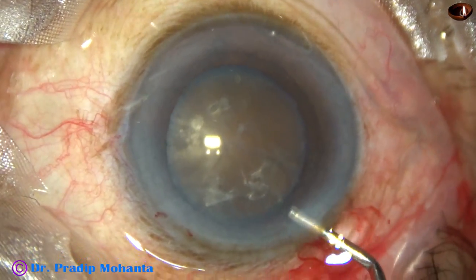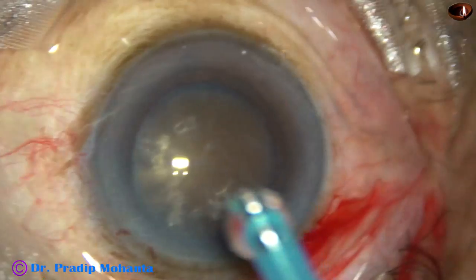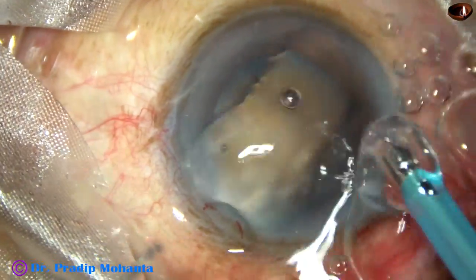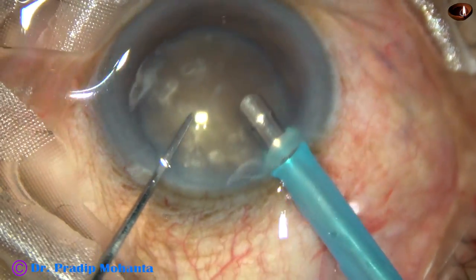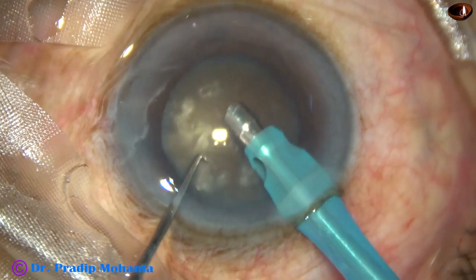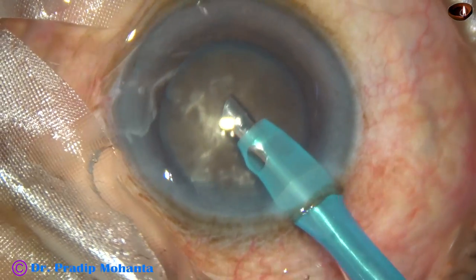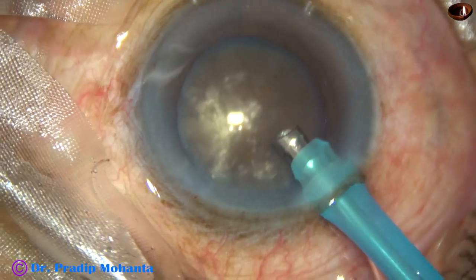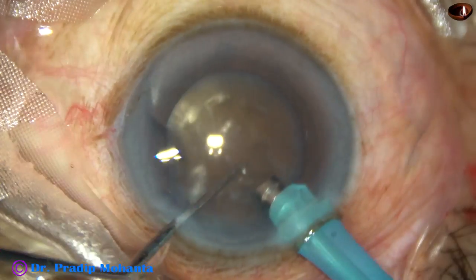Some more viscoelastic is added. And now the tip of the phaco handpiece — the tip of the phaco needle — is being introduced. Look at the exposed part of the phaco needle; it is more than in routine cases. This is to deliver more ultrasonic energy into the substance of the nucleus.